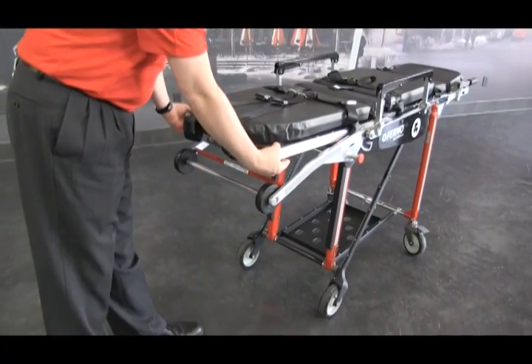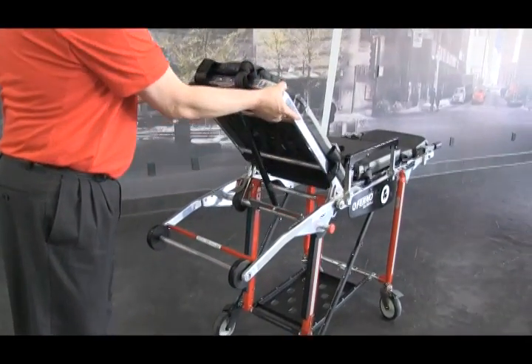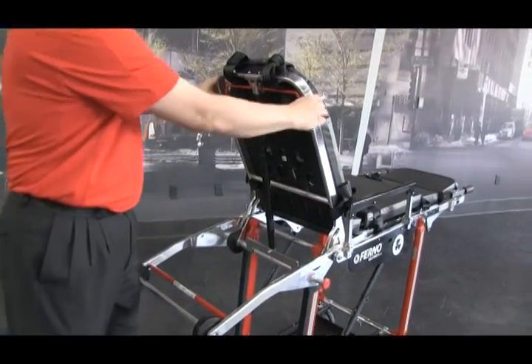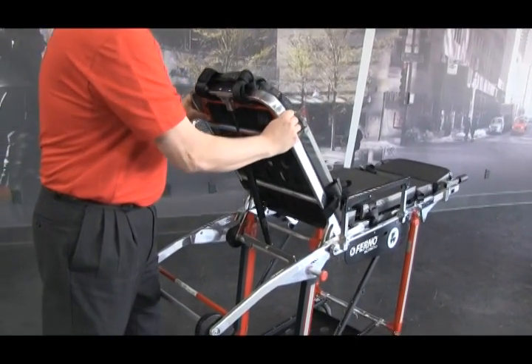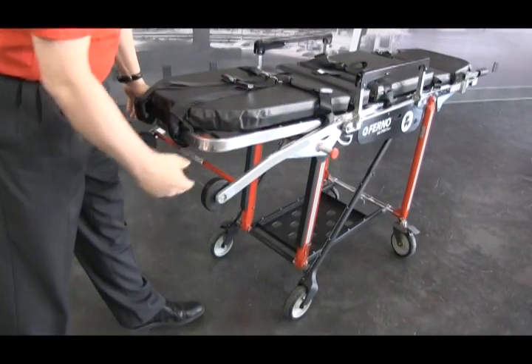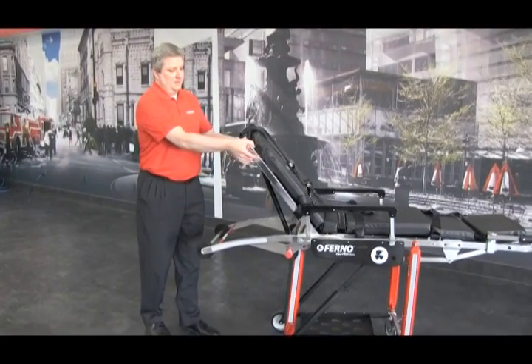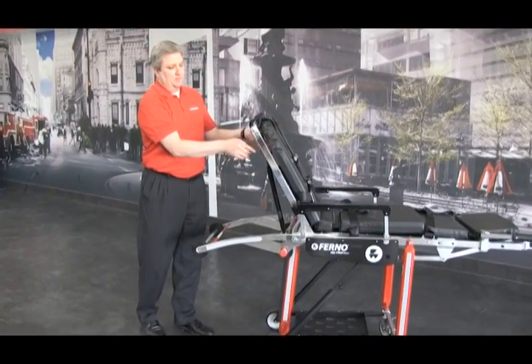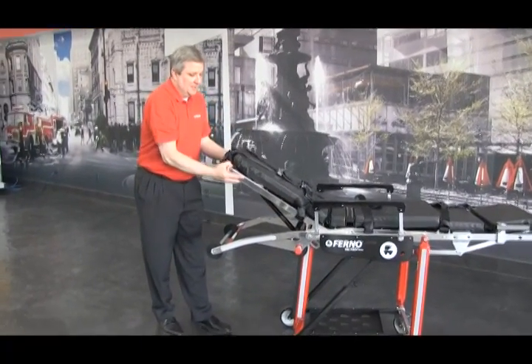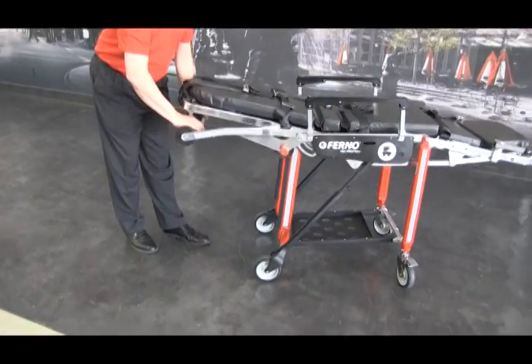To operate the backrest, there's a red release handle. Push the red release handle towards the patient to raise it up or lower it down. Again, push the red release handle towards the patient and pull it down. When adjusting the backrest, push the red release handle towards the patient, but always make sure the backrest is in the down position when changing the cot into the chair position.